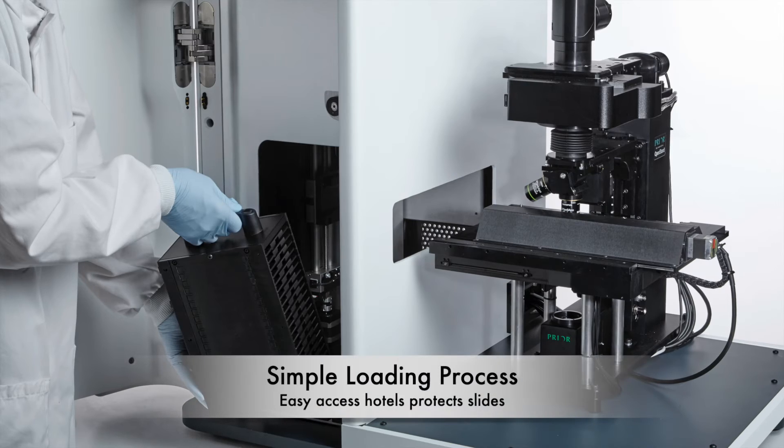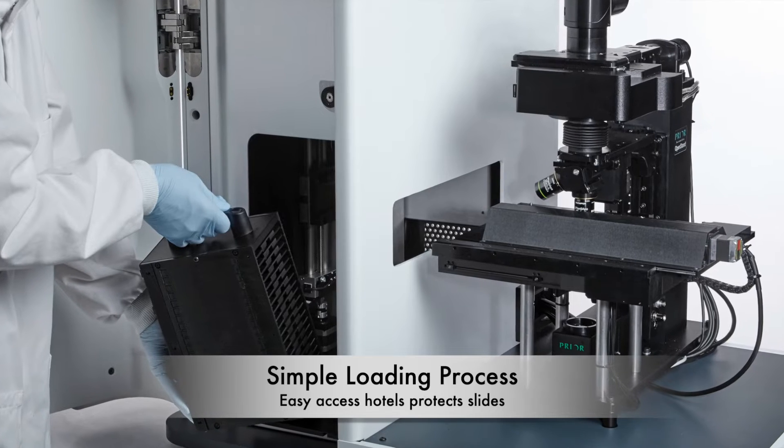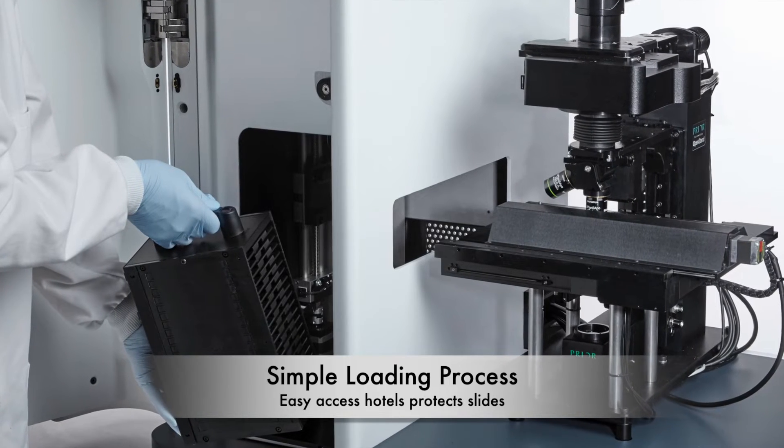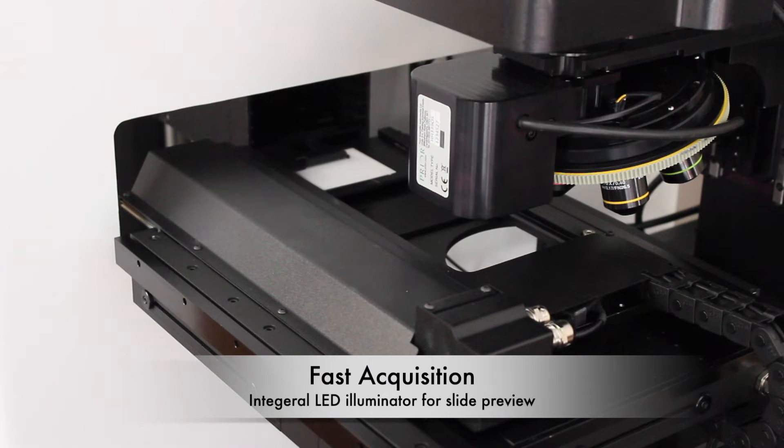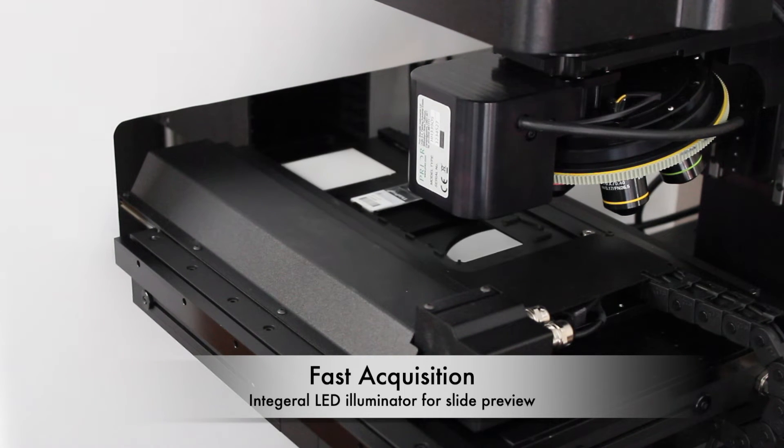The robotic mechanism in the loader transfers the slide holders from the hotels without touching the individual slides, ensuring slide safety and integrity. The SL160 stage comes with an integral LED illuminator for slide preview.